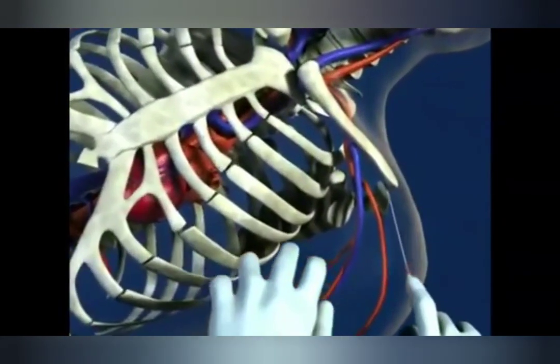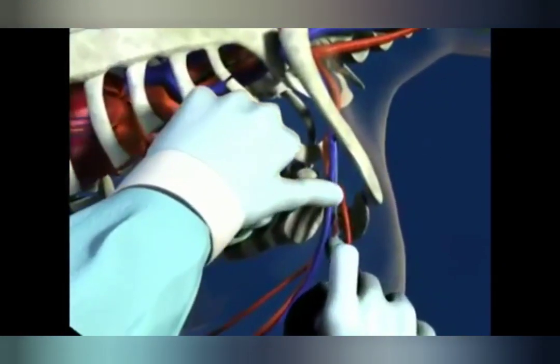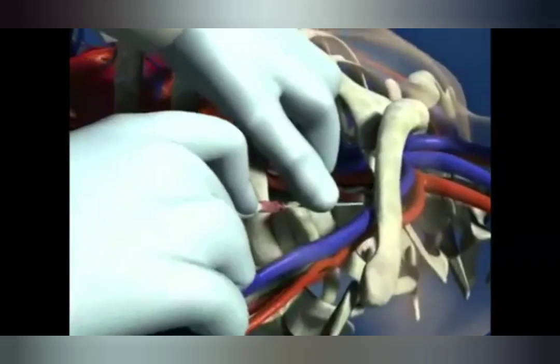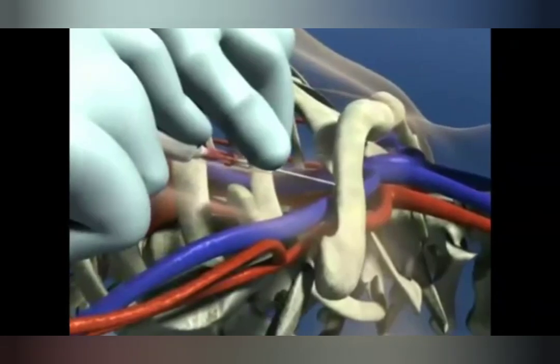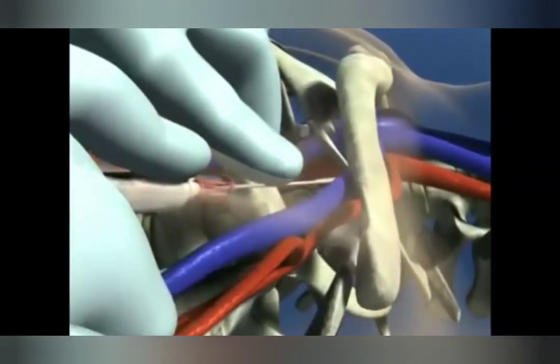The needle is not aimed posteriorly. Instead, a needle is inserted and aimed at the clavicle, but the thumb of the opposite hand is used to depress the needle down while maintaining a horizontal orientation. The needle is advanced until the clavicle has been encountered. After gently touching the clavicle, the needle is pulled back and further downward pressure is applied as the needle is advanced just below the clavicle.